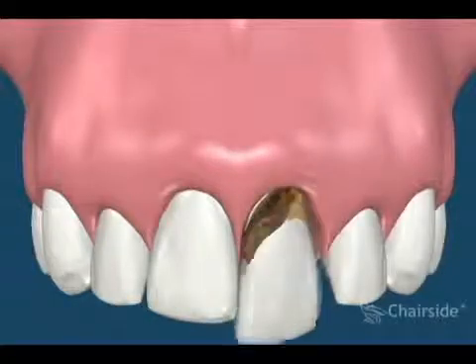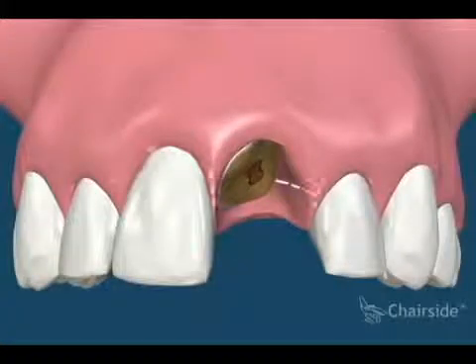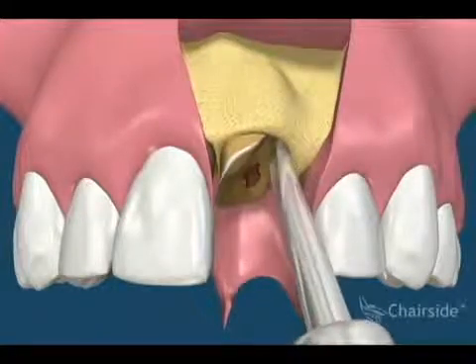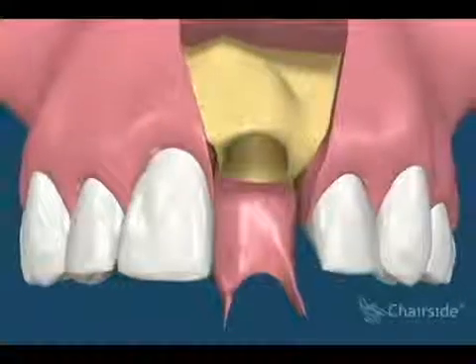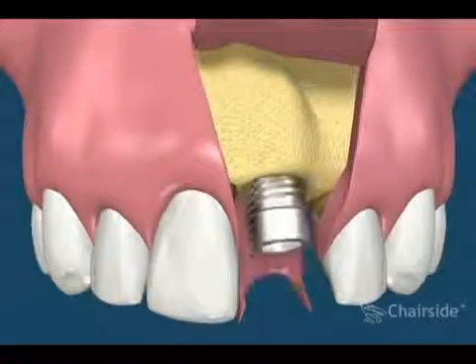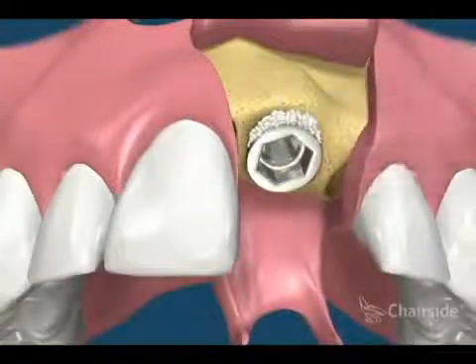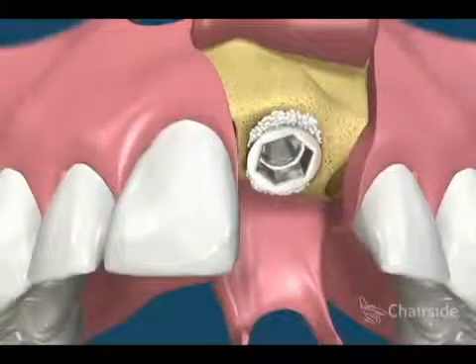This movie shows the extraction of a broken tooth with an implant being placed at the same time as the extraction. The gum is reflected and the tooth is carefully removed without damaging more bone. The void created by the tooth root is now ready to be prepared. The implant fixture is then placed into this prepared site. Note that there is a small void between the tooth socket and the implant fixture. Bone or bone substitute from various sources can be placed in the void.